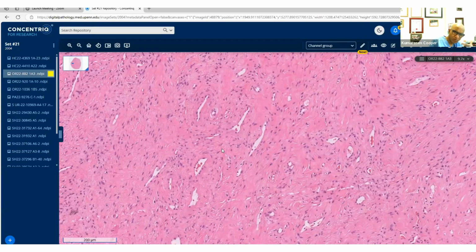Beta-catenin, I think in abdominal wall, abdomen, you have sweeping fascicles. Sometimes they do become quite difficult with differential diagnosis, particularly in needle core biopsies. So I think beta-catenin will be useful as well. Having a beta-catenin and MUC4 along with the basic panels we talked about, that would be useful, Carla. I don't know if you got beta-catenin yet. When I was there last October, you did not. So I would say get the beta-catenin and MUC4.